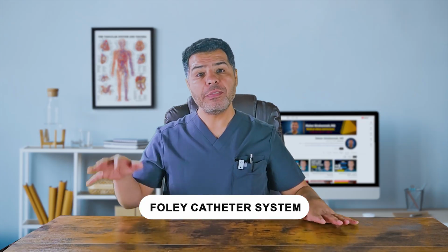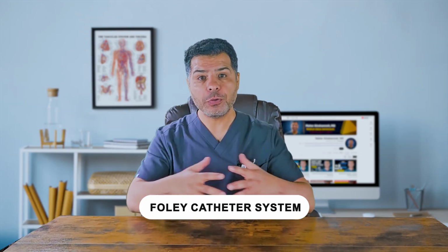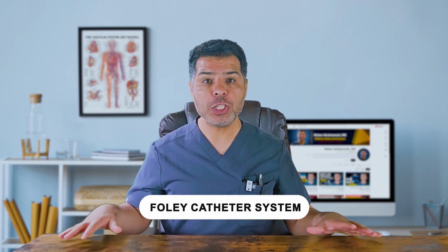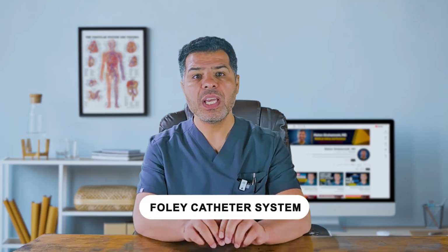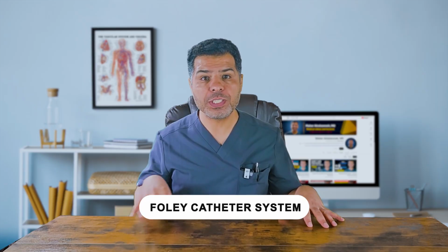Once the balloon is inflated, gentle traction should be applied to ensure the balloon seats at the bladder neck. You should feel resistance. This is normal here. And document the size of catheter, balloon volume used, and the patient's tolerance of the procedure. If insertion was difficult or traumatic, look for gross hematuria. A small amount of blood-tinged urine is common, but frank blood or significant hematuria needs urologic evaluation.